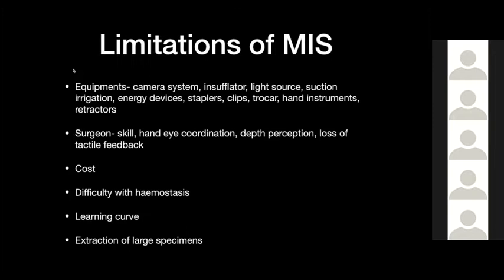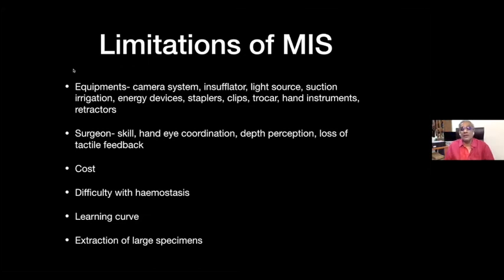That's why in our earlier era, a lot of senior surgeons found difficulty adapting to laparoscopy, and subsequently they thought it will be difficult for everyone. But time has shown that the younger guys adapted well and learned it faster, in fact. So that's how we started, and this is how we are now. Okay, so even the loss of tactile sensation has been accounted for, and we have improved on it, and instruments have got better, and we learned to adapt to pressure. So not necessarily putting your finger inside, we get indirect tactile sensation.